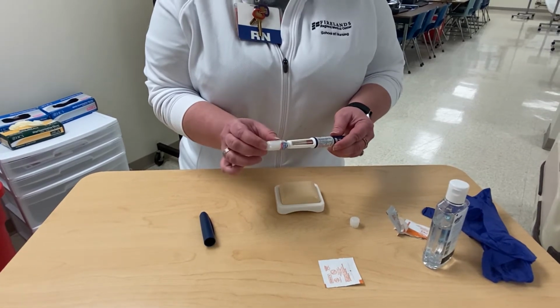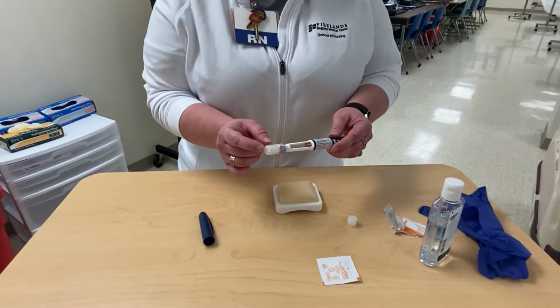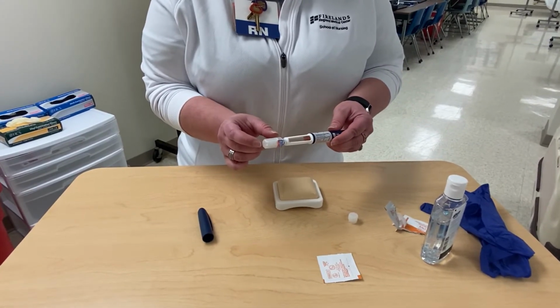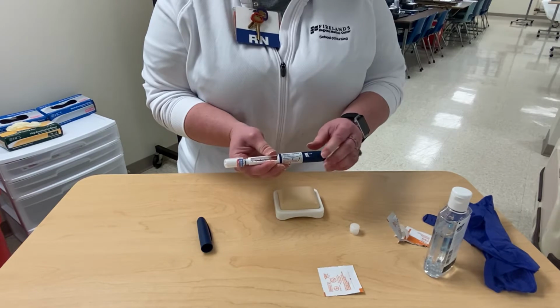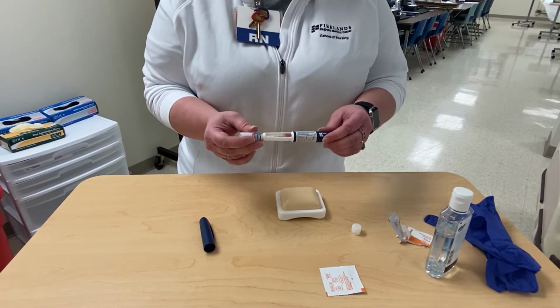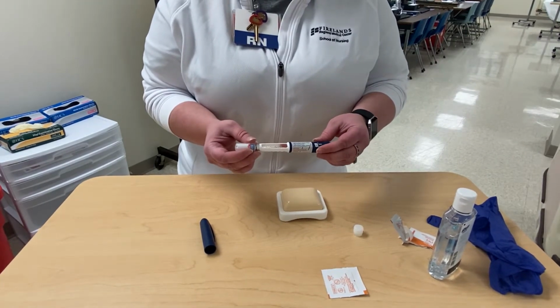We're going to leave this on until you actually administer it, but you'll be able to see the drops through the cap. If you don't see these drops, you can repeat these steps where you turn it to 2 units of insulin and press the plunger down 6 times. If nothing happens, then you have to call pharmacy for a new insulin pen due to malfunction.